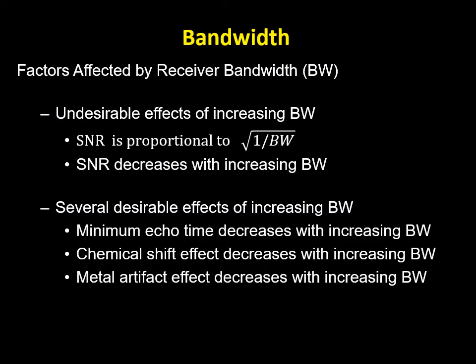Why bother with changing bandwidth? Why not just leave it the same all the time? Well, there are several factors that are affected by bandwidth, depending on whether you increase or decrease the bandwidth. Let's just look at what happens when you increase bandwidth. There are some undesirable effects. Most notably, since signal to noise is proportional to the square root of 1 over the bandwidth, signal to noise decreases as you increase bandwidth.